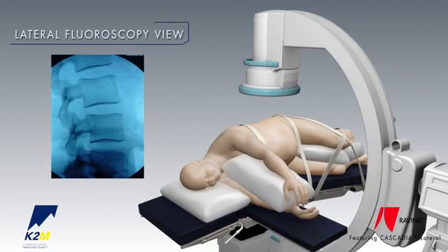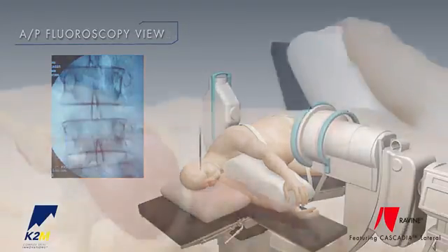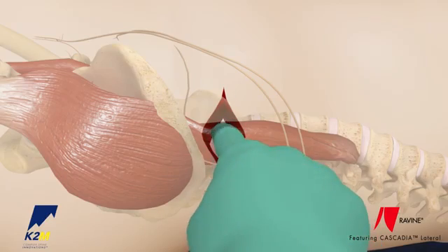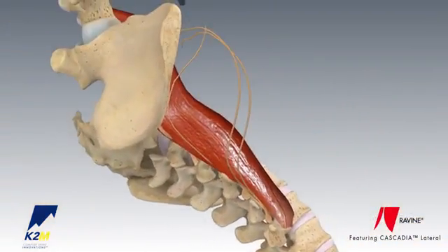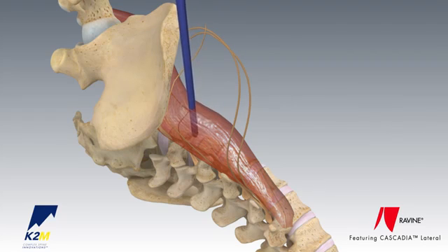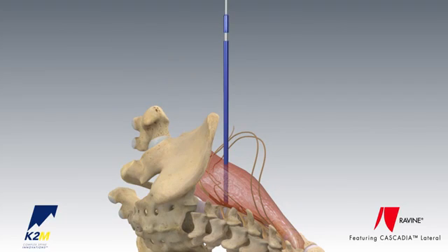Next, fluoroscopy is used to identify the correct operative level and a skin incision is made targeting the middle of the disc. Finger palpation of the psoas muscle, or the anterior tip of the transverse process, is used to confirm the proper location. Once verified, the initial 6mm dissector is introduced into the prepared path and advanced through the psoas muscle, and the dissector is docked directly onto the middle of the disc.